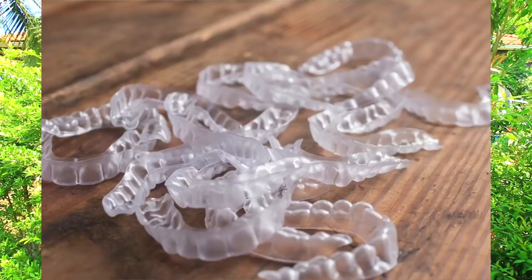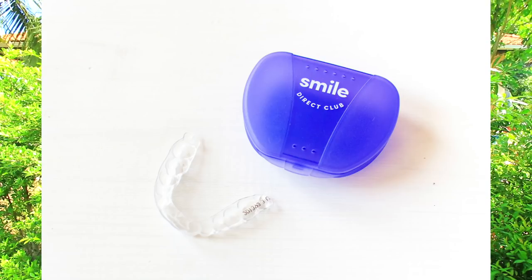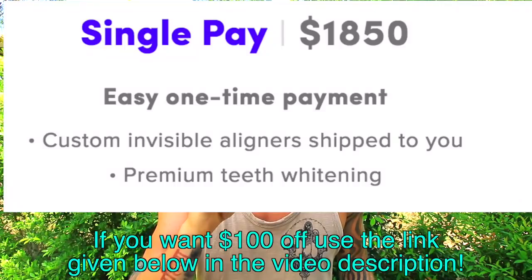They give you four different molds to put on your teeth, you mix the putty together and put it on. They give you all the instructions in the kit. You also take certain photos and send the kit off to them. Once you've done all that, they will assign a specific orthodontist or dentist to you. They'll have a look at the impressions and the photos, then go through the process to create your invisible braces.